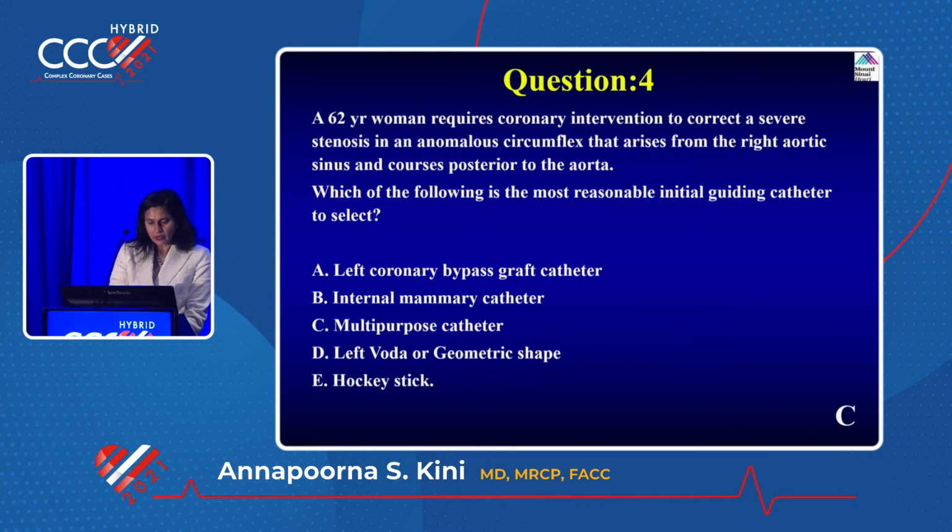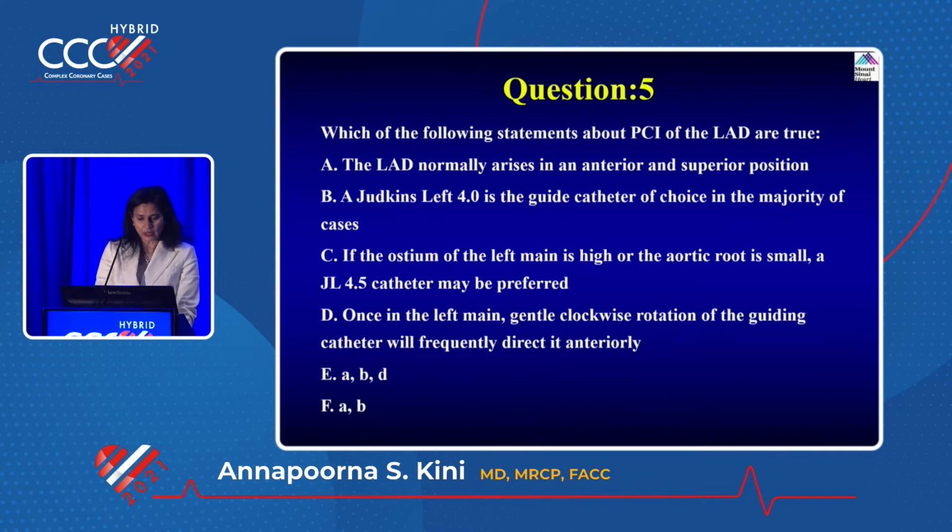Okay, everybody understood this? Anomalous origin of the circumflex, very common. So remember that, which will be AR1, if not multipurpose, because it could be a takeoff down, but AR1 is the catheter of choice, because you could have to do intervention in the circumflex that you're seeing here.